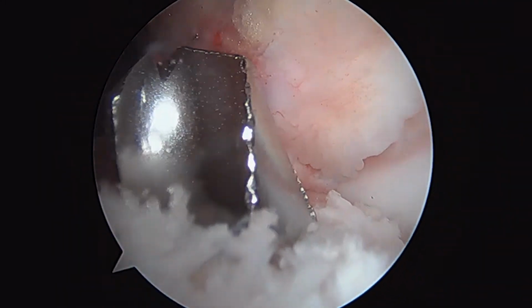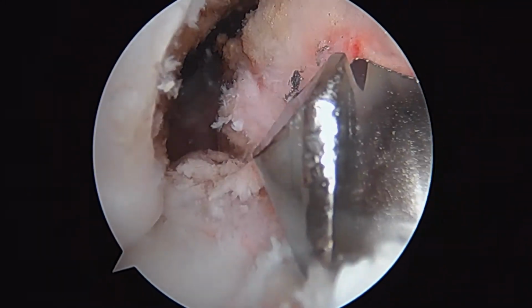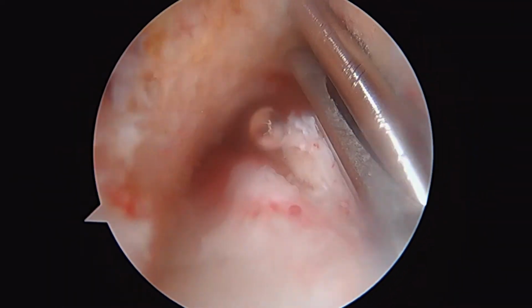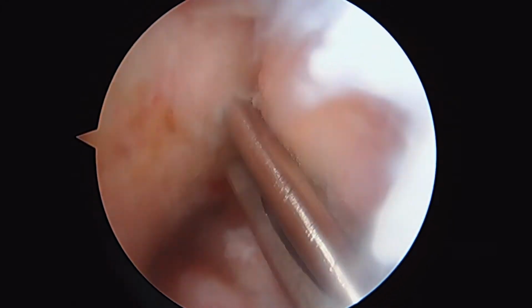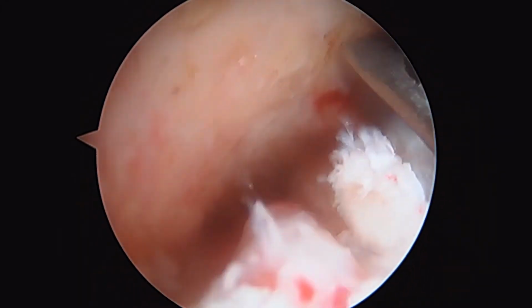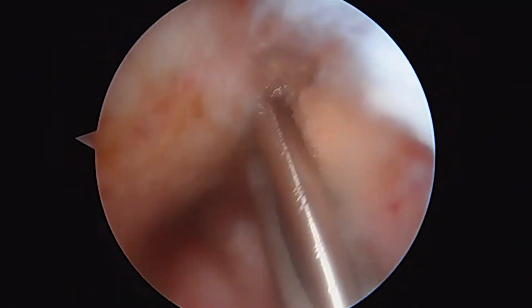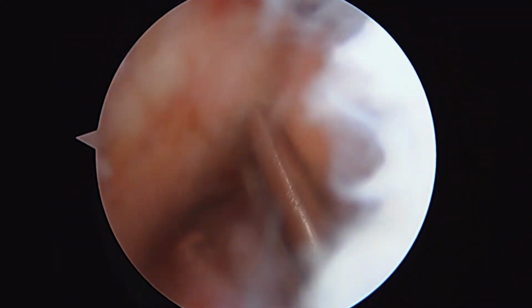Okay, so here's the drill coming in just to show you how we make a hole in the tibia there. Here you go. Okay, here's our 6mm over the top guide. We're happy with that position. If I pull back, you can see we're all the way in the back. We'll show you some more in a minute.